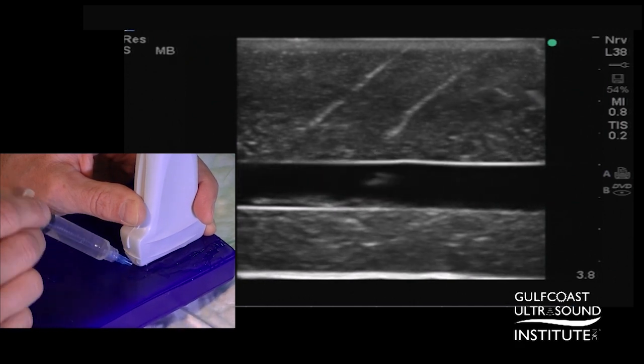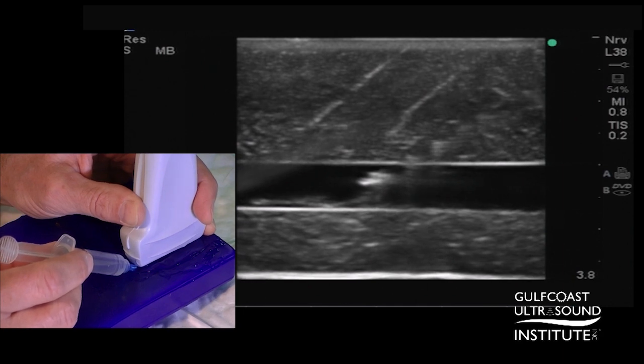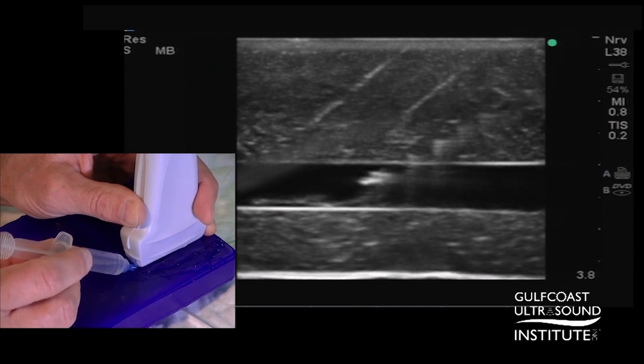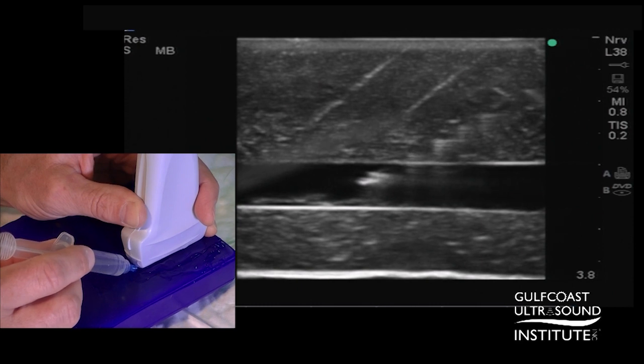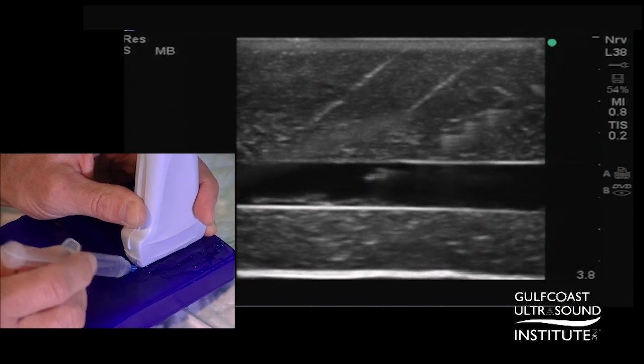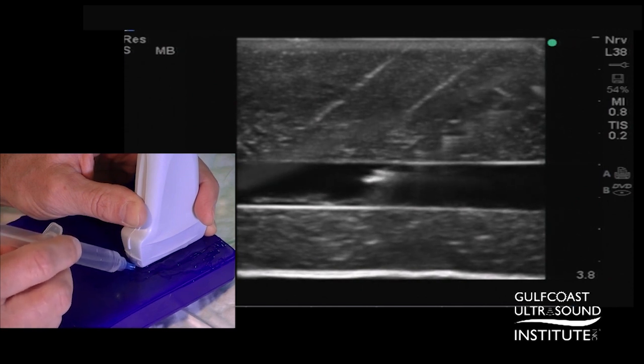So I'm in the center of the target image. This was all the in-plane or longitudinal approach to a target structure using the freehand technique, showing the importance of stabilizing that probe and using a slight side-to-side motion to stay within the imaging plane as you advance. That's my hot tip for today. Now you give it a try.